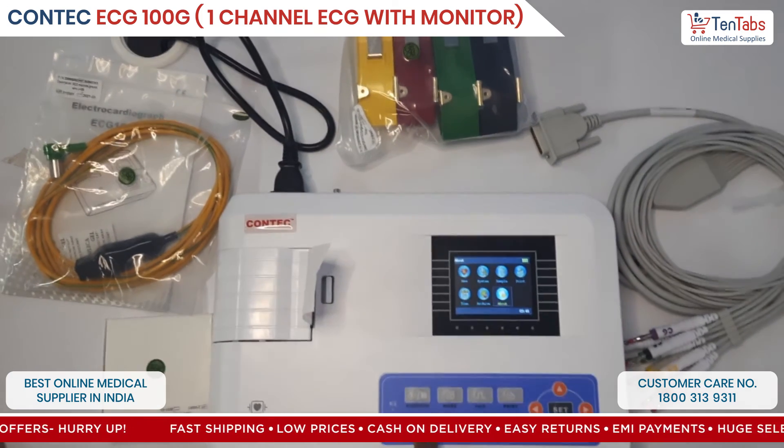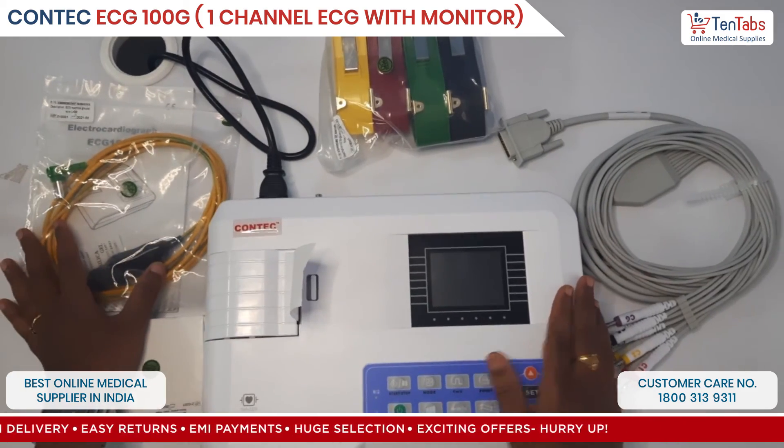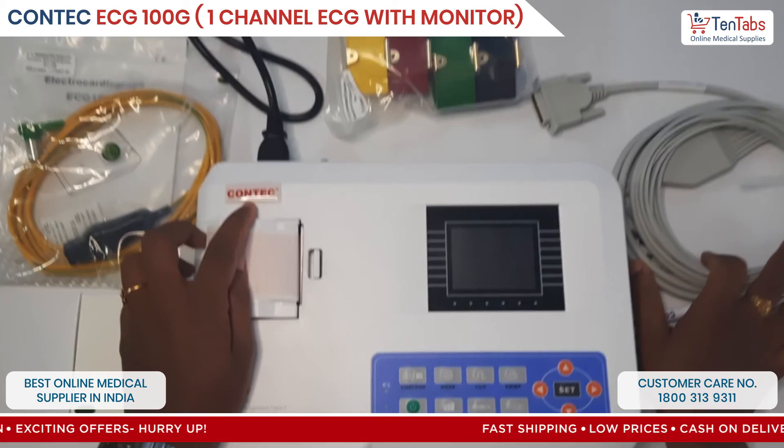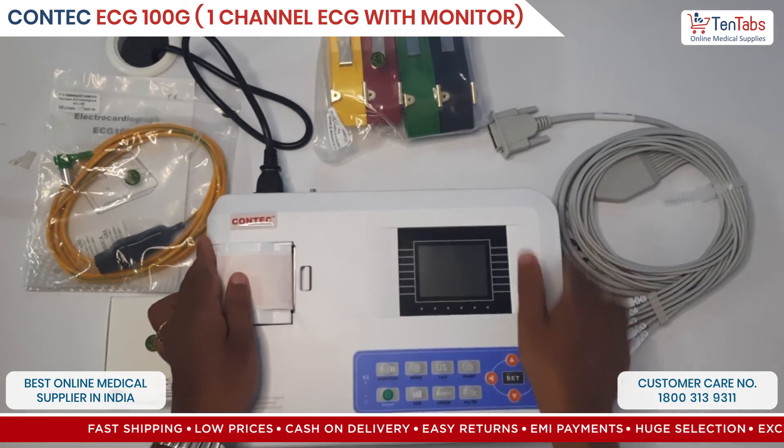To power off, long press the power button. So that's the installation and unboxing video of the KONTEK single channel ECG machine, which is 100G. Thank you all.